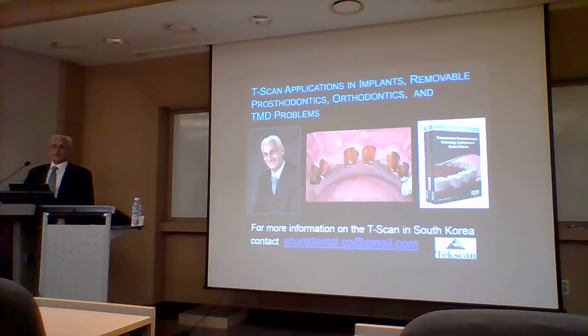You have to learn how to record well, which is a skill. You have to learn how to analyze the data well, which is another skill. You have to be able to tell when the recording is good or bad and throw it out if it isn't good. And you have to be able to transfer the information to the mouth in an intelligent way. So there's a whole series of things someone has to learn that require an effort. And we run into this all the time.